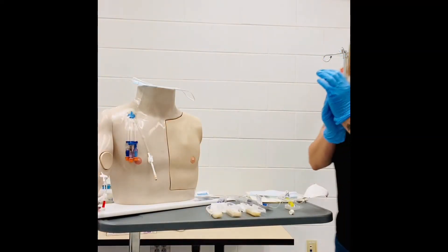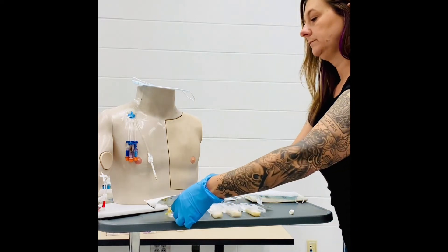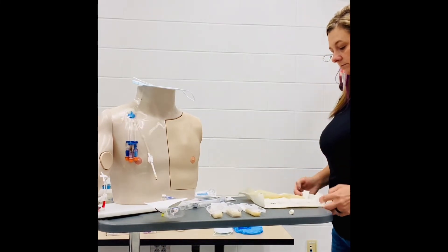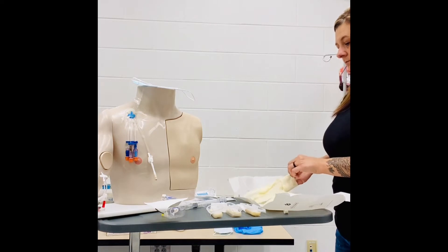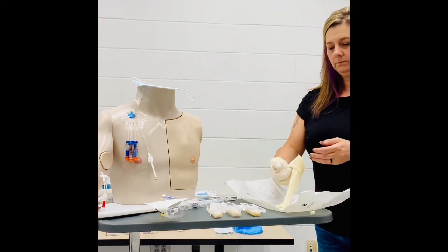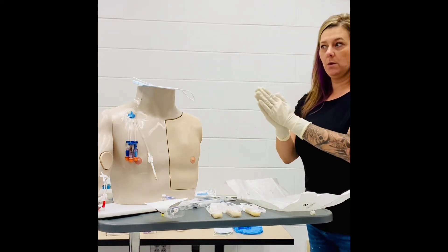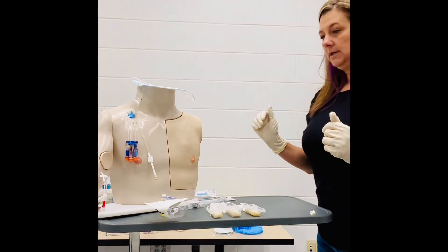Now we will remove these gloves and wash our hands, and we're going to don our sterile gloves. Once we have our sterile gloves on, we know that we're sterile and we need to be cautious about what we touch. I can go ahead and move this out of the way, and now I'm ready to begin to insert our Huber needle.